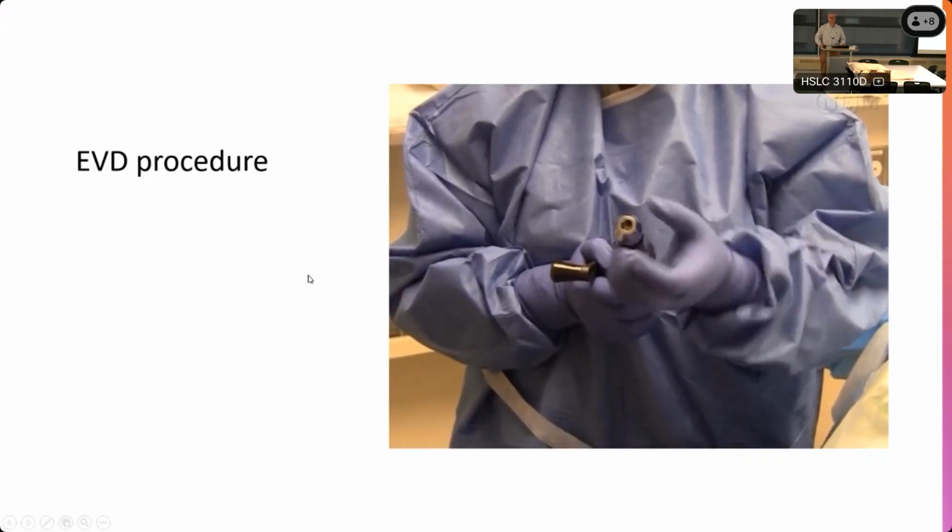That drape is big. I think you should drape as much as you possibly can. A lot of the kits don't have very large drapes, so extra towels and extra sterile sheets can be very helpful. Otherwise the drain will flip around and flop around, and once it gets unsterile, you have to start over and over again.